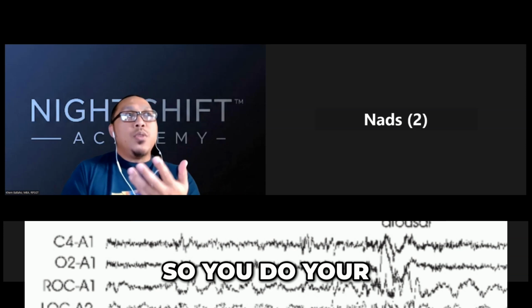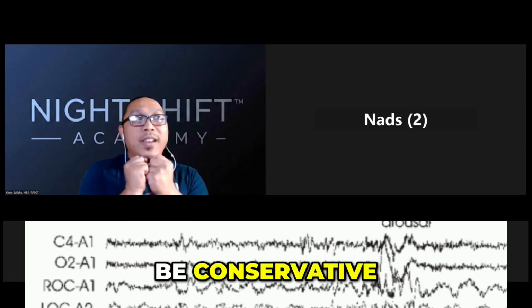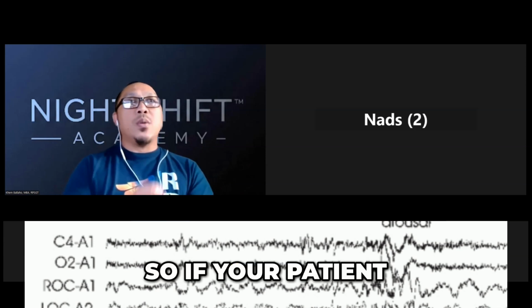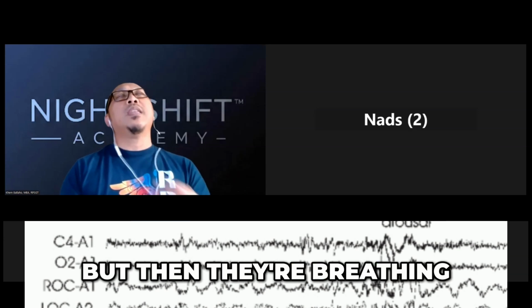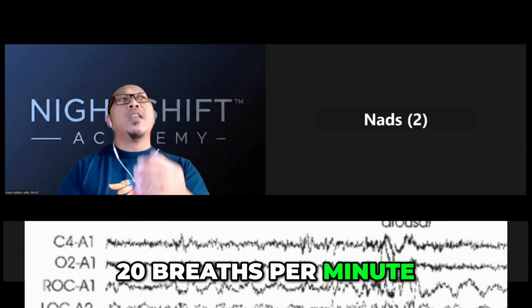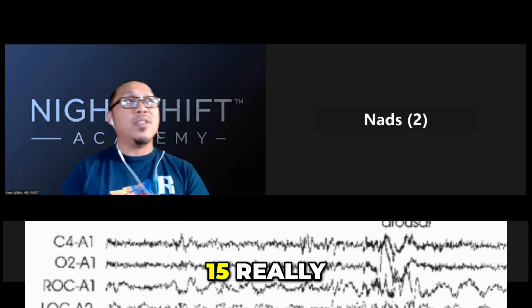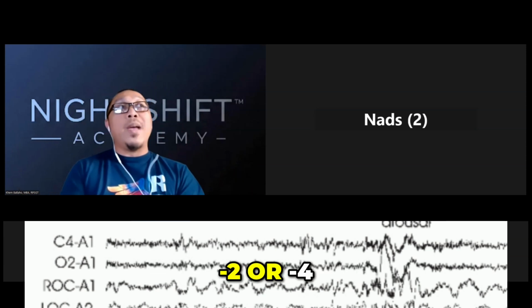Let's say that patient's rate is 16. So your backup rate should be -2 or -4. If you want to be conservative, -4. If you want to be a little bit more aggressive, -2. So if your patient is at 20 and they're resting, breathing 20 breaths per minute, your backup rate could be 16. You can even go 15, really. But that's how you can establish that. So you won't go wrong if you do -2 or -4.